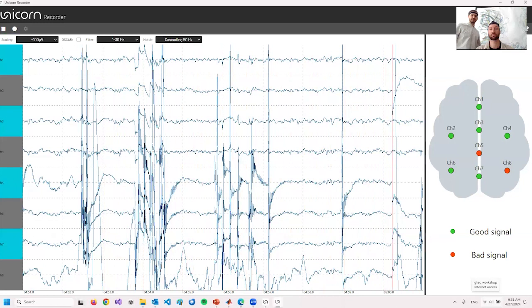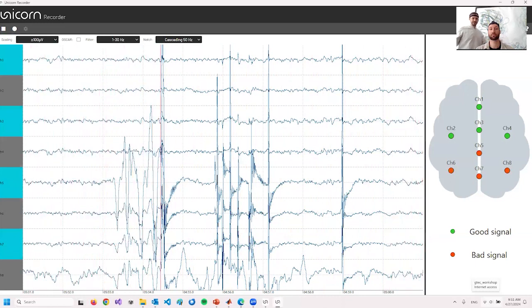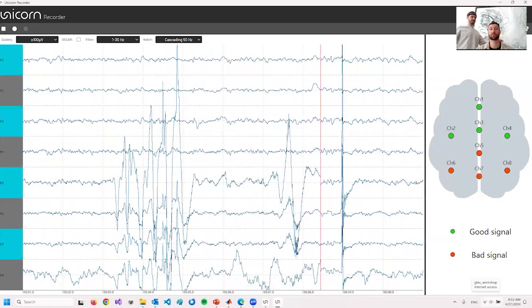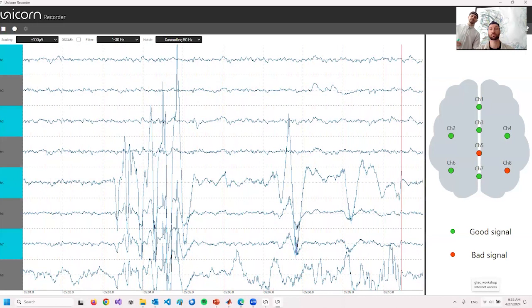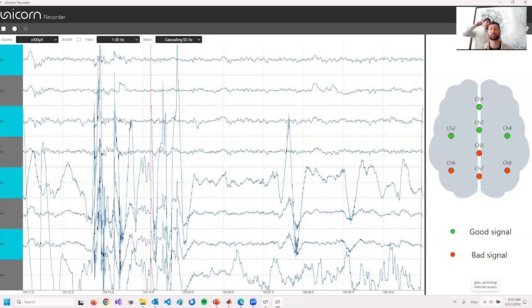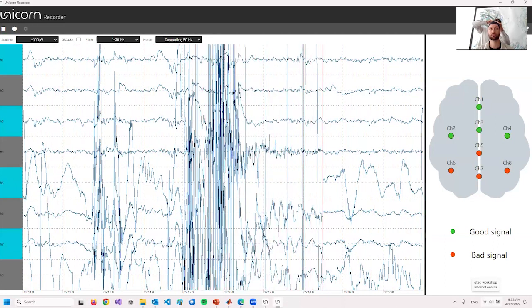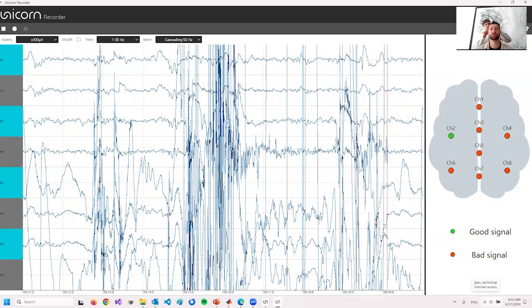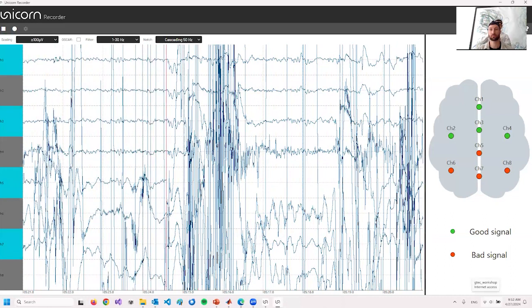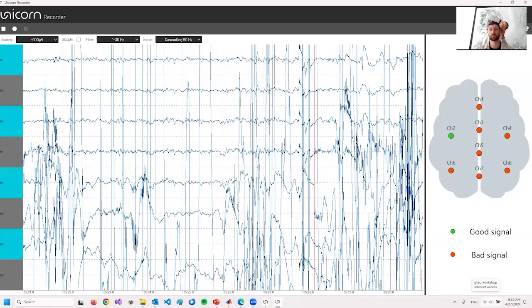So now you can see the first electrodes are pretty stable. And if I move around the side, the first electrodes are not disturbed, just the electrodes in the back. And that's the influence of the gel. So with gel, you just get a better connection between the skin and the electrode. And therefore, we can measure some more clean EEG. And right now I'm preparing the last 4 electrodes as well.